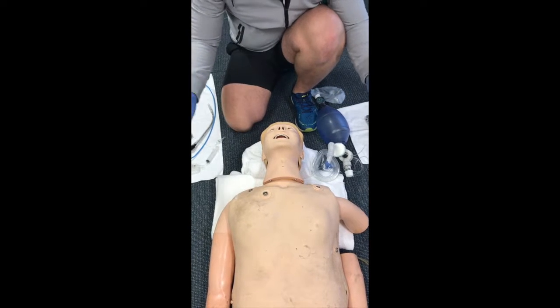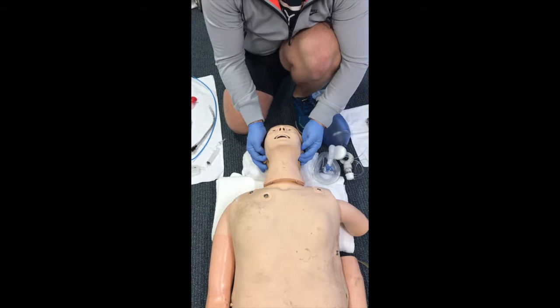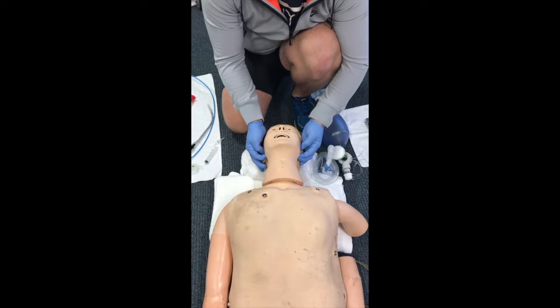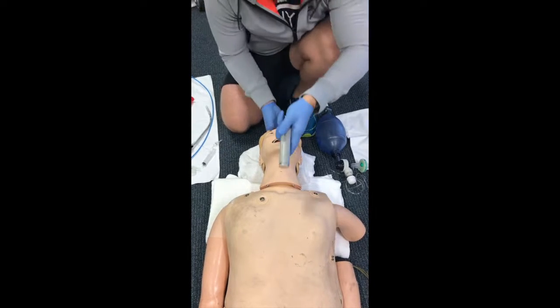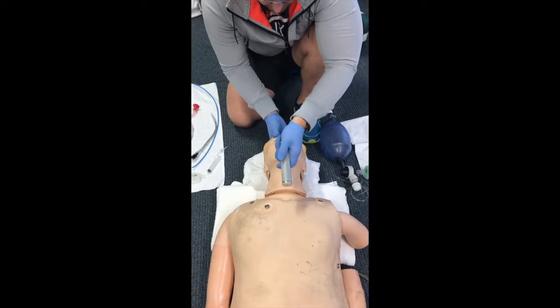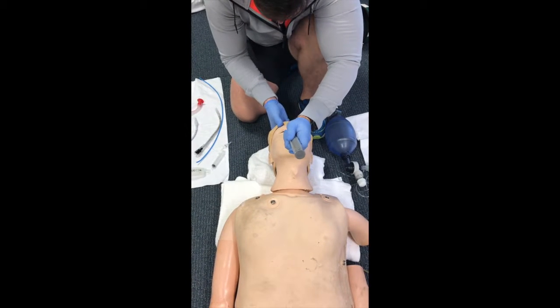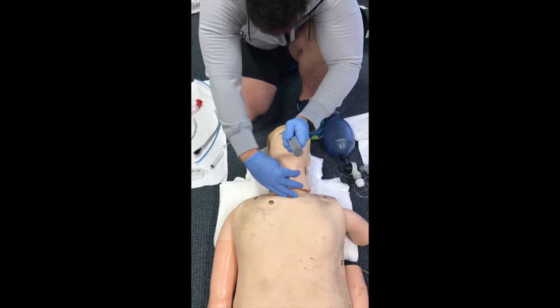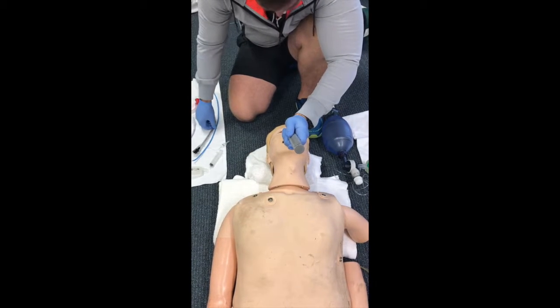I can also grab another assistant to do some jaw thrust for me here and just lift the actual mandible up for me, like so. So I'm going to have another attempt, advancing the blade into the right side of the mouth, sweeping the tongue to the left into the vallecular groove, and I've got my assistant with some external laryngeal manipulation.